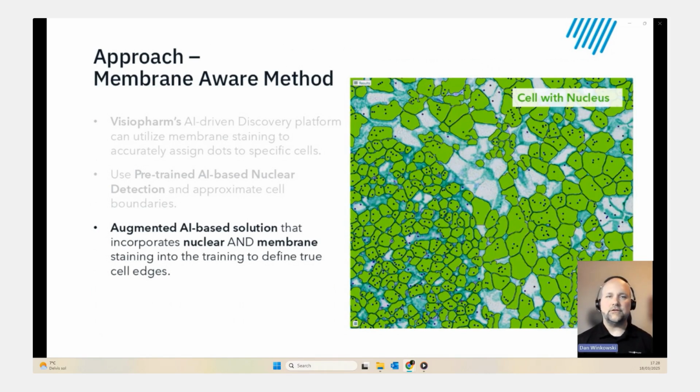You'll notice right away that each labeled object closely follows the full morphology of the underlying cell objects in the image, which will therefore build our confidence in our ability to assign dots to specific cells rather than wondering which dot goes with which cell. Notably here, I'm showing only the cells that are identified to have a nucleus.